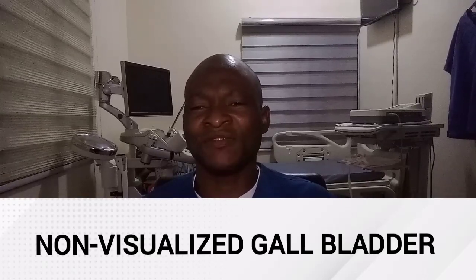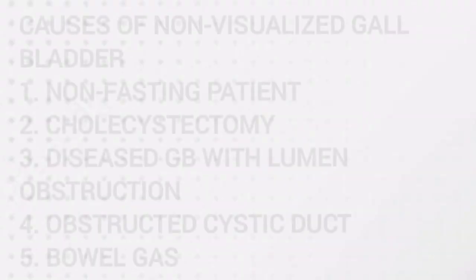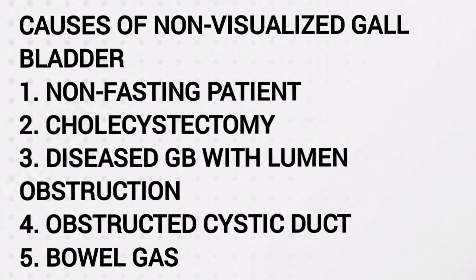The causes of non-visualized gallbladder include a non-fasting patient. In a non-fasting patient, the gallbladder may be too small or contracted to see any fluid contents. 12 hours fasting is ideal for this case. However, at least 6 to 8 hours is adequate for hepatobiliary examination.